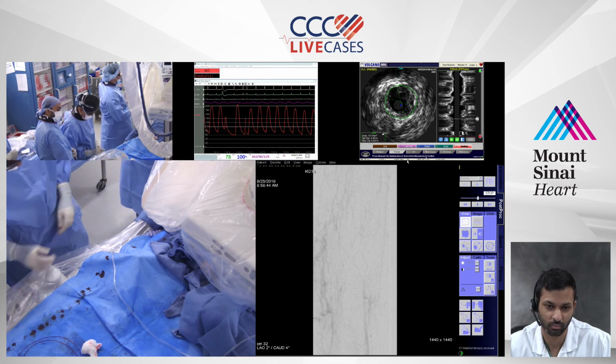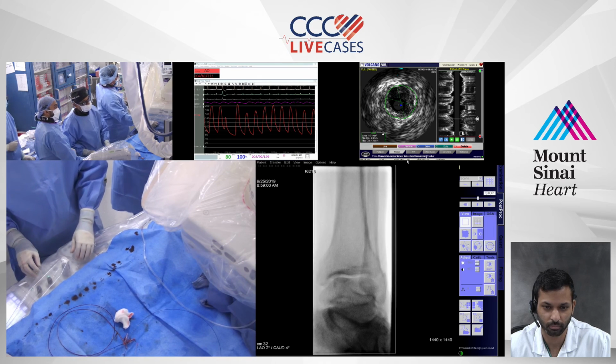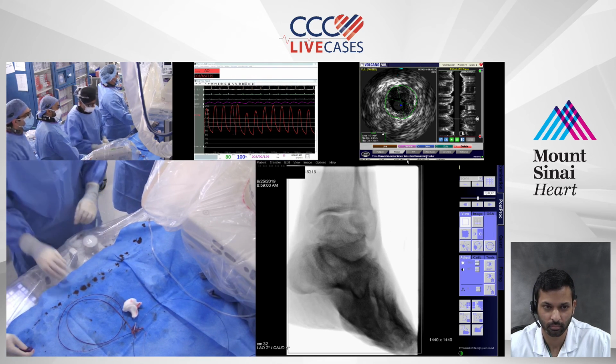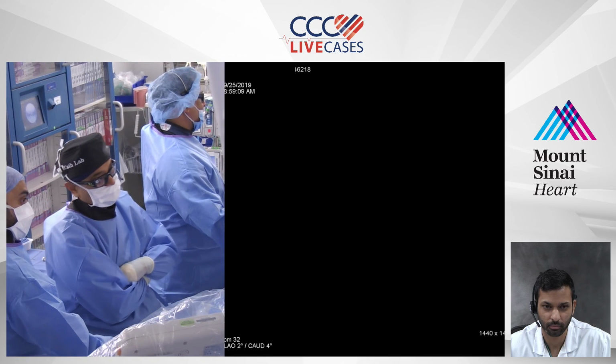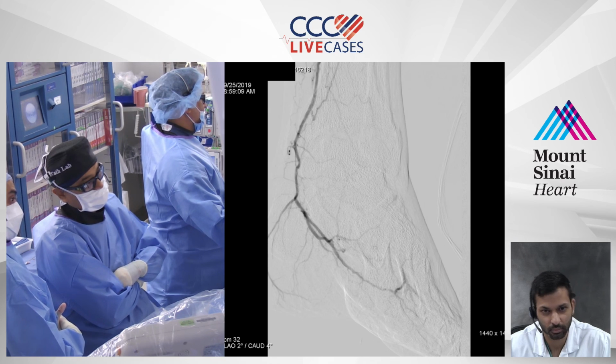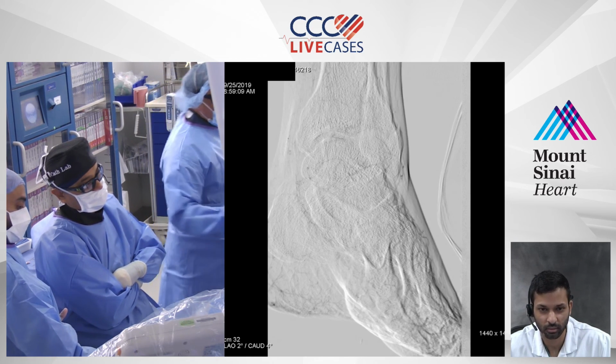Show us a foot shot, please. Now I'm just going to pull my wire back a little bit so I don't confound anything. Now wide, open it up nicely, please. Show me the whole foot. Okay. Inject. So there's our foot. Beautiful. So I think we're going to stop here.